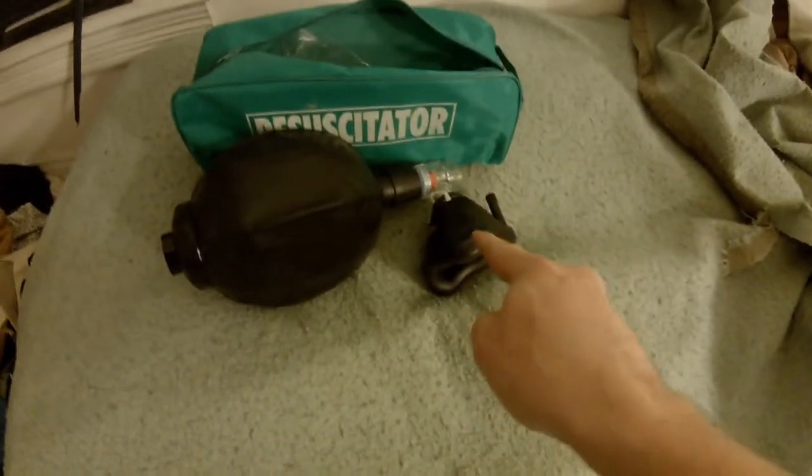Hey entertainer heads! Guess what time it is? Time for Mr. Entertainer's Medical Mania! All right, this week we are looking at the BVM Resuscitator — Bag Valve Mask Resuscitator. Get it? It's a resuscitator.